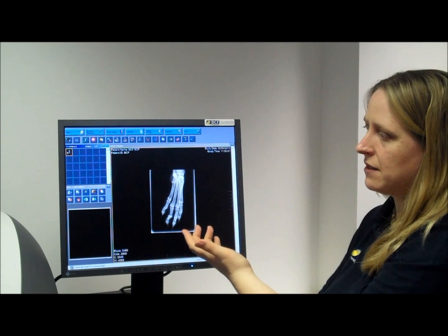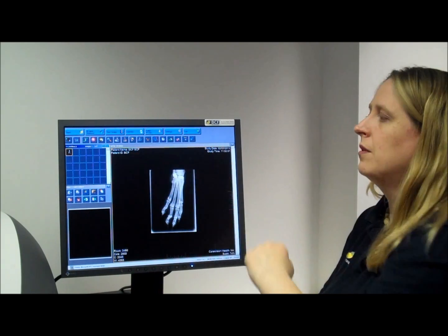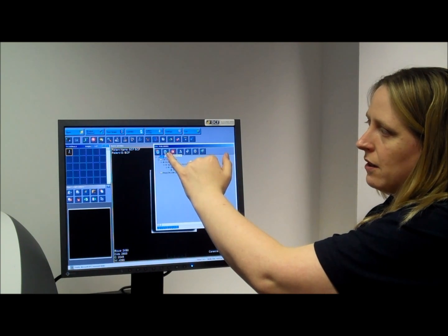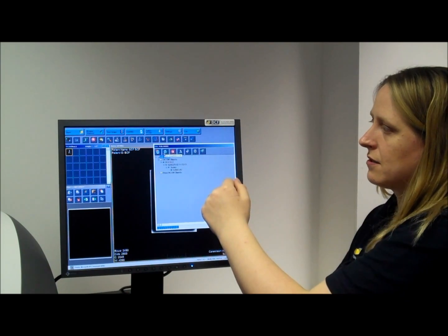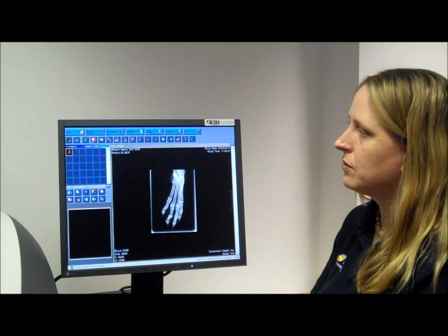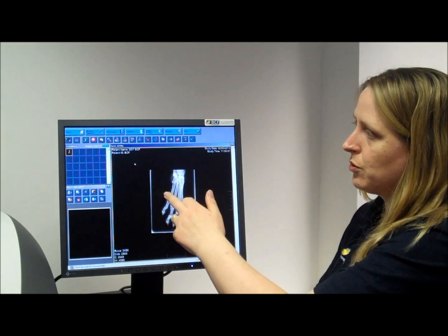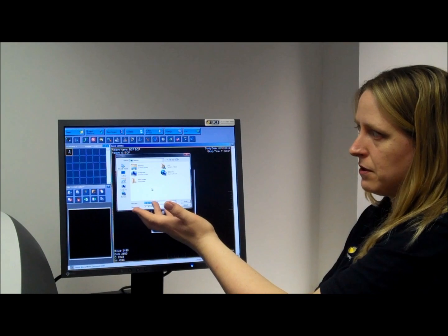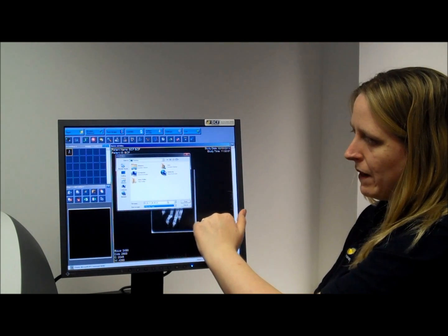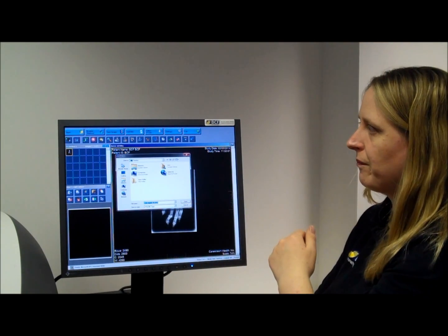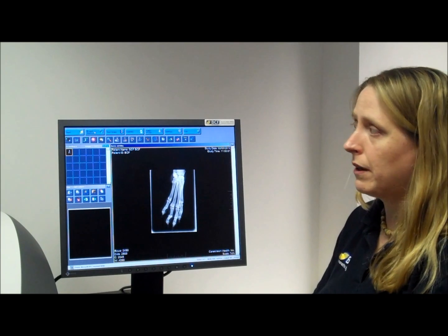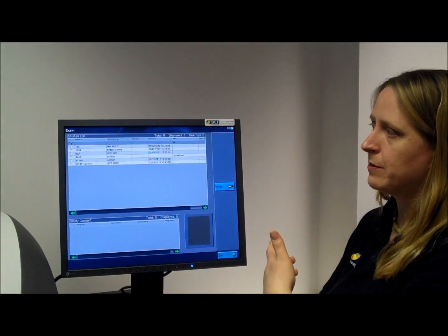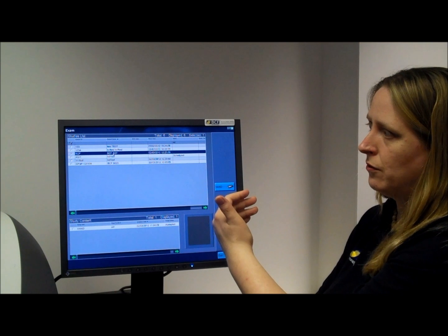If you want to save the picture to disk, just hit CD, New, and then you can drag your thumbnail into the box. Then by clicking burn to disk, it will burn you a disk. If you want to save your image as a JPEG, make sure the picture you want to save is on the main screen, hit save image, export image, and it brings up your computer file browser — choose JPEG, input the name you want to save under, and hit save. If you want to browse the database from here to see if the patient has any additional pictures, just click onto browse database and it will take you back to the database page where you can search for the patient's images.